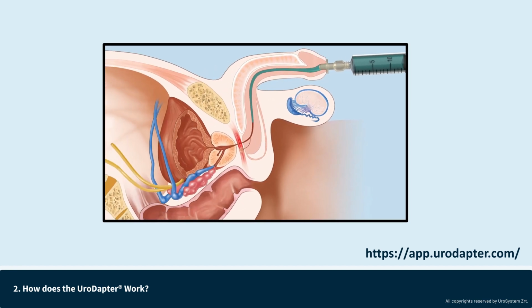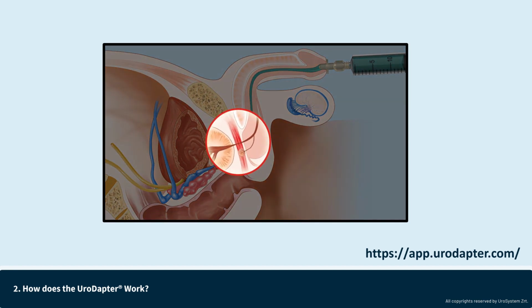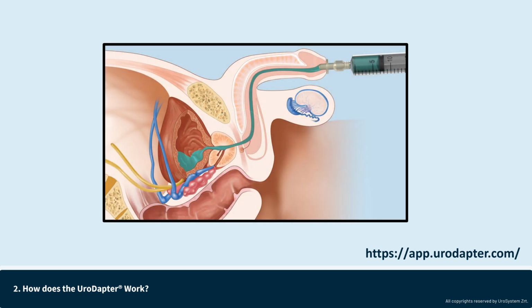Slow down or pause the instillation if the sphincter is still constricted. Instruct the patient to take a few deep breaths and relax his pelvic muscles and sphincter. Resume only when the patient has relaxed his sphincter.